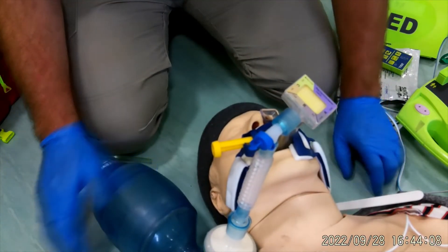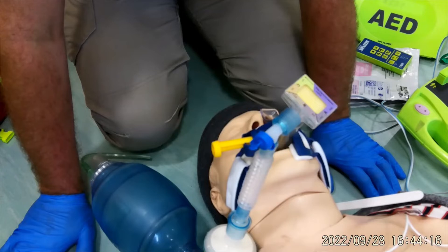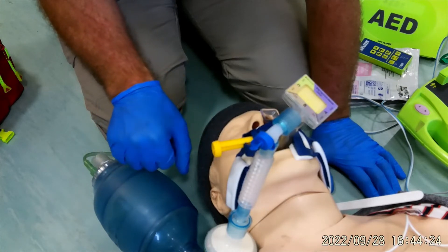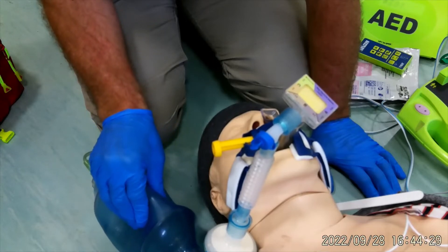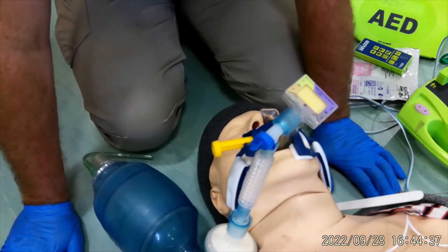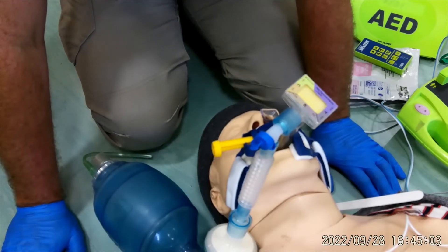I'm now going to attempt asynchronous CPR. While my colleague does chest compressions, I ventilate by squeezing the bag about a third, once every six seconds — one and two and three and four and five and squeeze. My colleague can now do continuous chest compressions for a full two minutes while I ventilate every six seconds. Every time the AED analyzes we all stop and reassess. Previously we needed to remove oxygen a meter away from the pads, but now I have a closed circuit I can leave all oxygen running whilst delivering a shock.